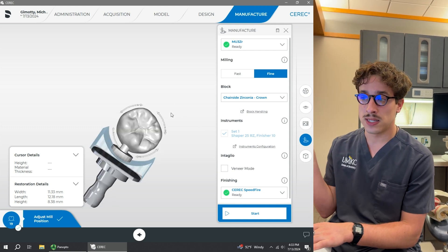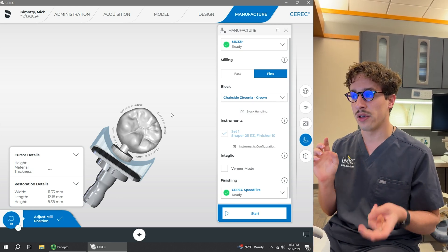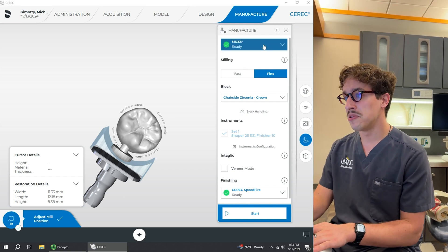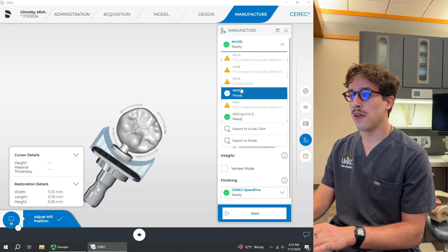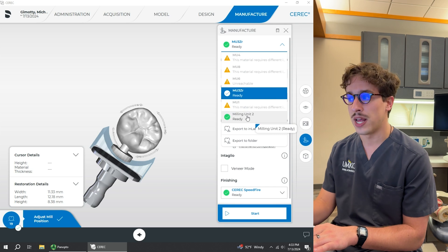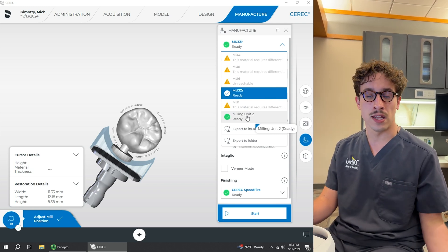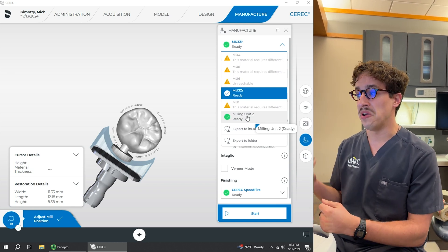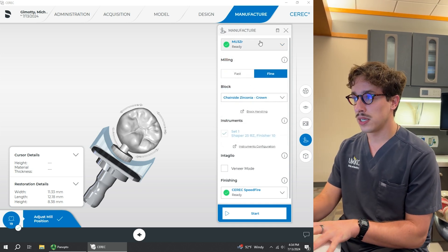If we set everything up correctly in the initial portion — choosing the correct material and the correct milling unit — we won't have to change anything here. Just to go through it one more time: select the milling unit. If we selected zirconia, it's not even going to let us mill on the non-zirconia mills. It has to be either number two or number three for zirconia. If it's emax, you can use any of the others — we normally use one or number eight. We can select either two or three; we have three selected right here.